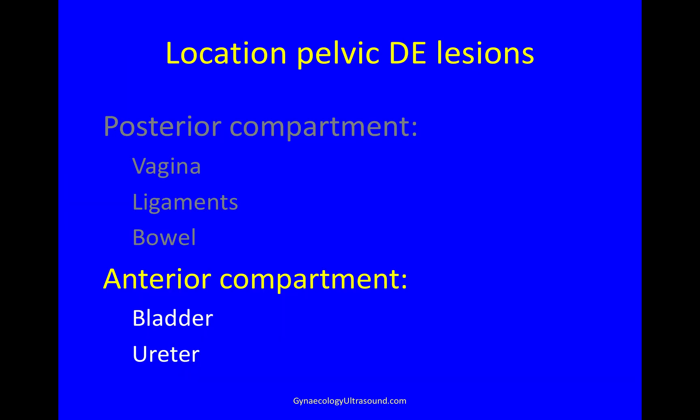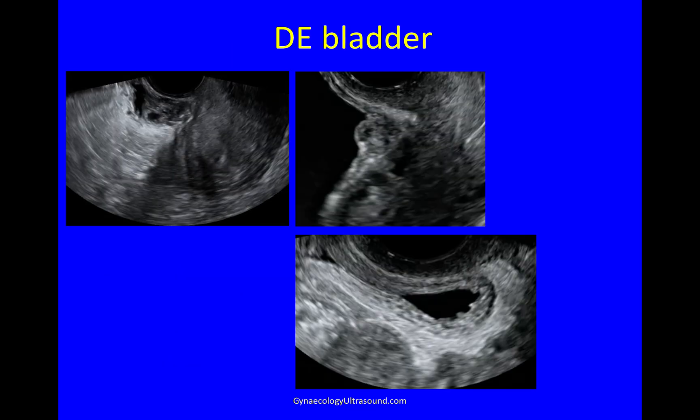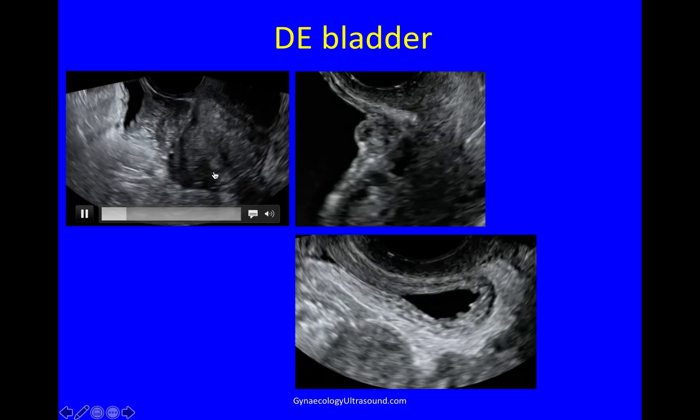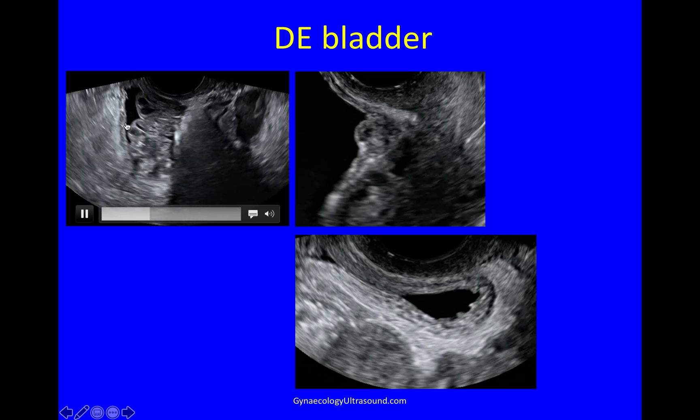At the end of the scan, don't forget the anterior compartment, looking at the bladder. And in this case, this is a very large bladder nodule of deep endometriosis.